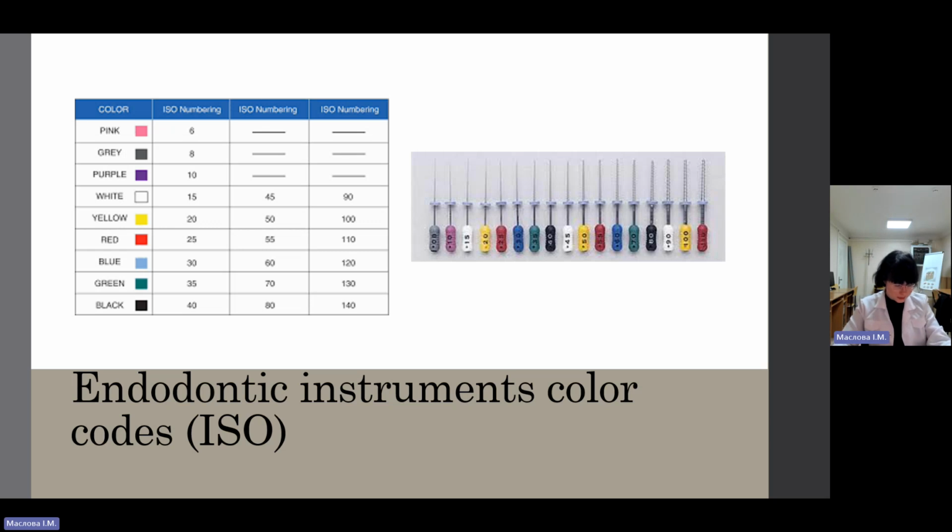Basic instruments. A basic selection of instruments should be packaged or set up in a tray ready to use. A flat surfaced mouth mirror produces an undistorted image of good visibility deep within the pulp chamber. The endodontic explorer is a double-ended, extra-long, sharp instrument designed to help in the location of canal entrances and for detecting fractures. A long spoon excavator is required to remove pulpal content and soft caries where present.